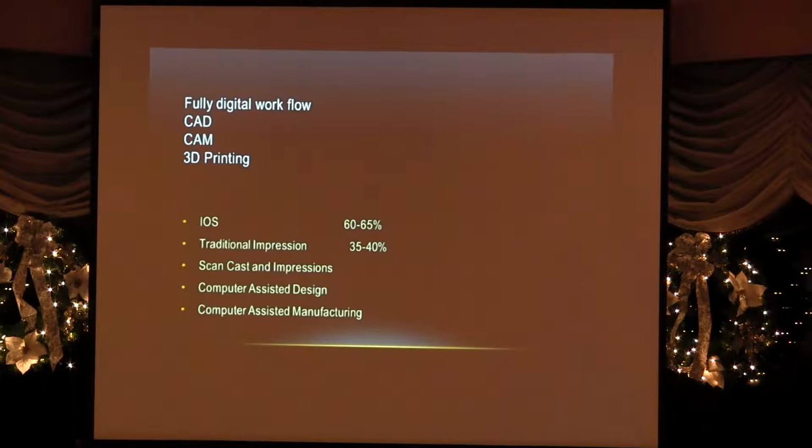Can you scan any impression material? Yes, we do, but most of the time we pour models first and scan them. Even though I use the 3Shape system, and it can scan even a lower anterior case, we try to just pour the model first. But in some cases where we don't have time to pour the model, we can scan the impression also. But we only scan the impression when there is a post and core involved, because it's the negative impression, and we have much better luck scanning the post itself in an impression.